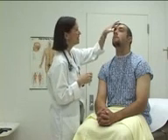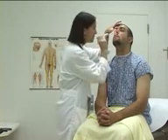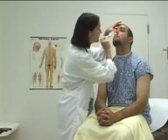Next is the nasal exam, which is simple, only has a couple steps. You ask your patient to tip their head back, compress the tip a little, light both nares, and then look to see if there's any evidence of a nasal perforation, and you're done with that part of the exam. Next is the oral exam. You use your pen light, which you place in your non-dominant hand, and your tongue blade, which you place in your dominant hand because you want control of how you use the tongue blade.